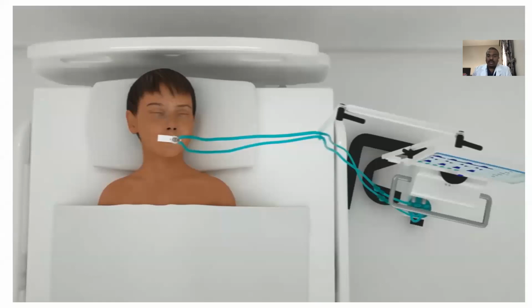Okay, ECMO is a life-saving procedure used in intensive care medicine to provide both respiratory and cardiac support for patients whose heart and lung functions are compromised. It is also known as extracorporeal life support, or ECLS. It is a form of modified cardiopulmonary bypass in which venous blood is removed from the body and pumped through an artificial membrane lung, in patients who have refractory hypoxemia or cardiac failure. Oxygen will be added, carbon dioxide will be removed, and the blood is returned to the patient, either via another vein to provide respiratory support, or a major artery to provide circulatory support.